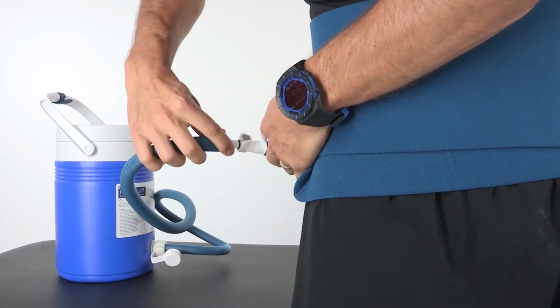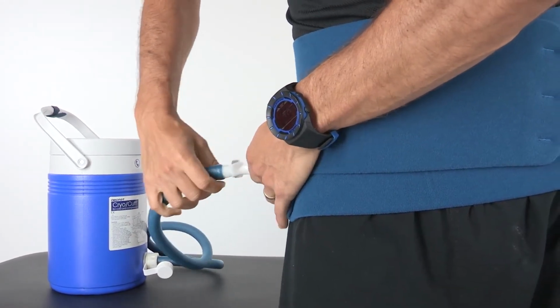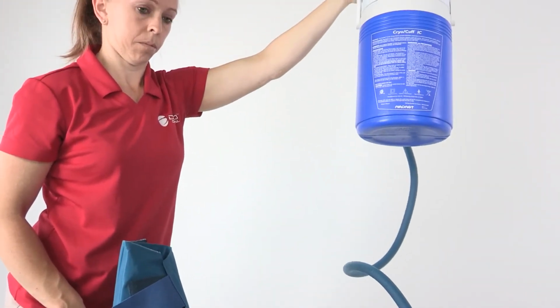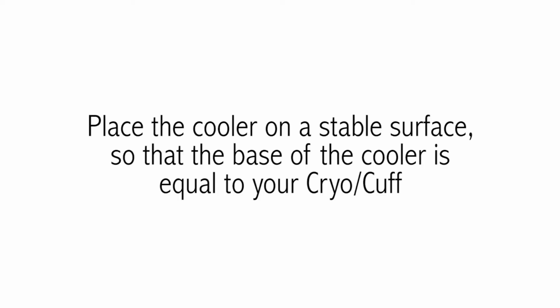To fill your cuff: 1. Attach the blue tube to your CryoCuff. Listen for a click to ensure proper connection. 2. Lift the cooler 12 to 15 inches above your cuff. This will take approximately 45 seconds. 3. Place the cooler on a stable surface so that the base of the cooler is equal to the CryoCuff to ensure optimal performance.